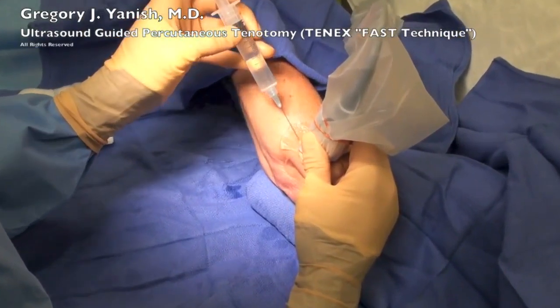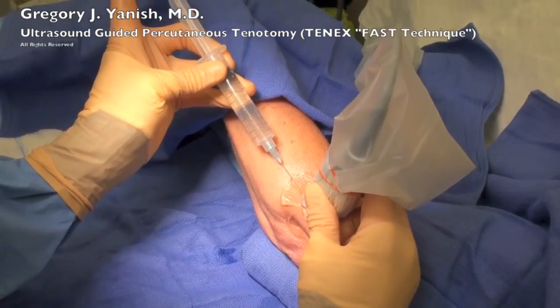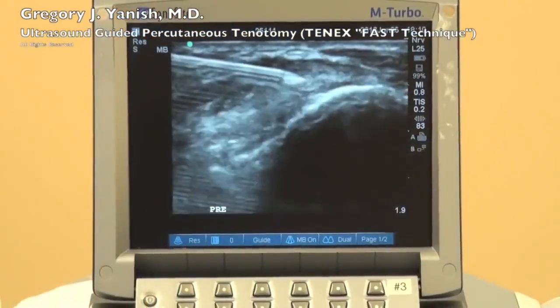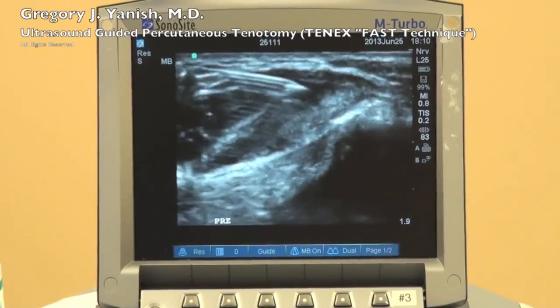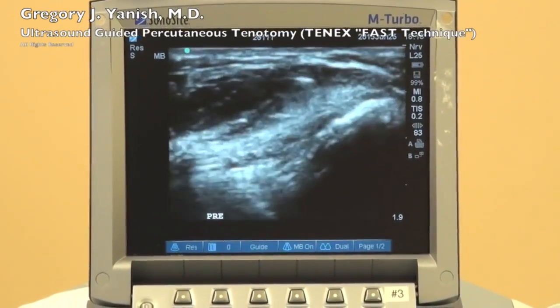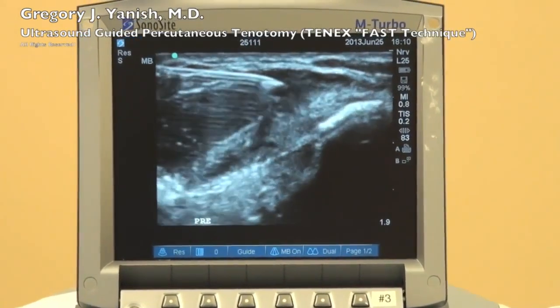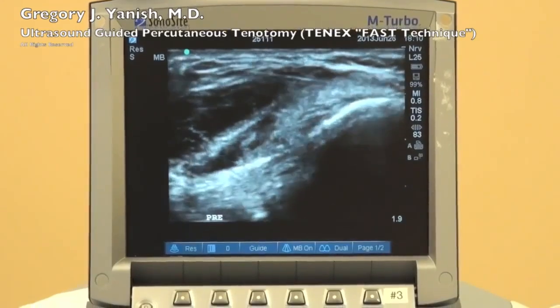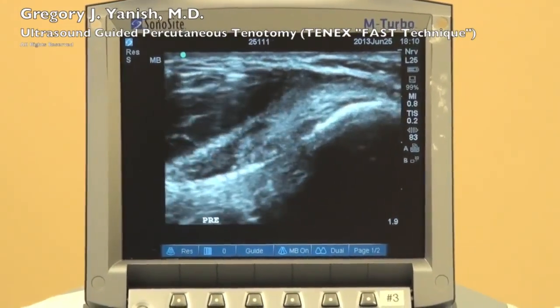This is the installation of the local anesthetic. The patient is actually awake and is not under any sedation. You can see the needle on my screen entering the common extensor origin and the subcutaneous tissue overlying it. Doing this under ultrasound allows me to place the medication immediately into the area that I'll be working on, as well as use less medication.